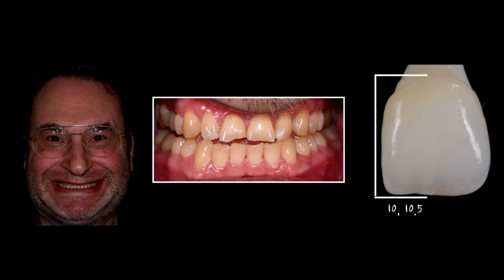Now, when the scans came over, Dr. Bernadette's concept was she was going to measure the lip dynamic and the movement and see where we were. And I thought, okay, that's great. That's really the perfect thing to do. But let me just wax the teeth really quick. Let me just throw a little wax on there so you can put that in the mouth.